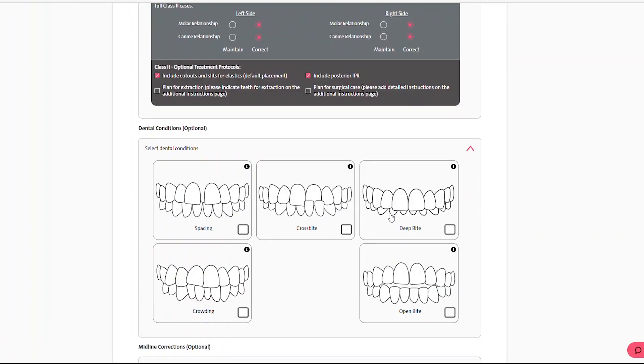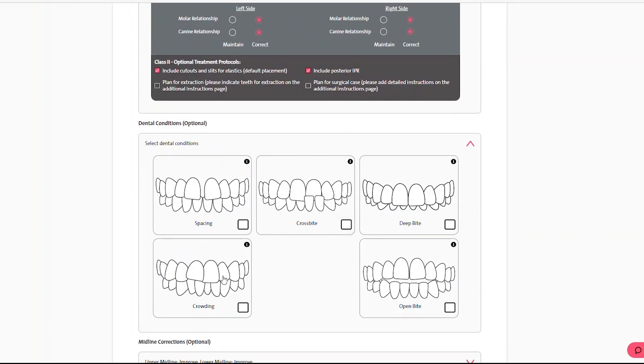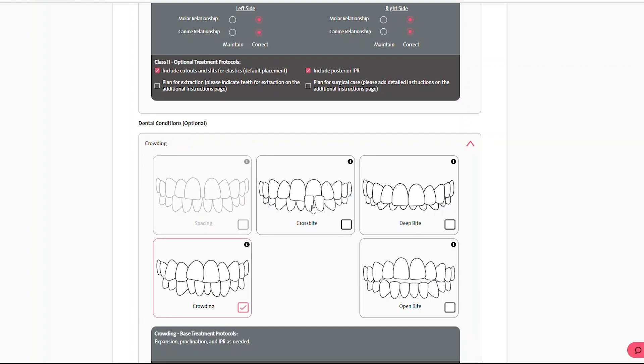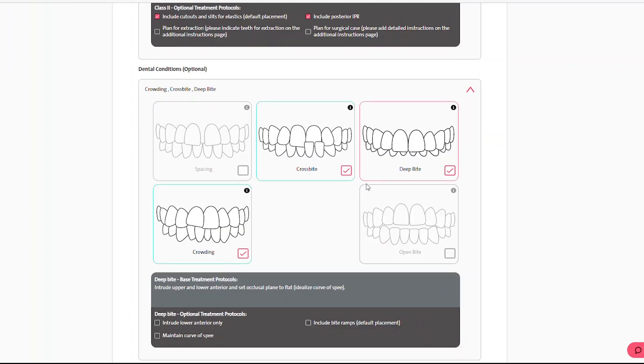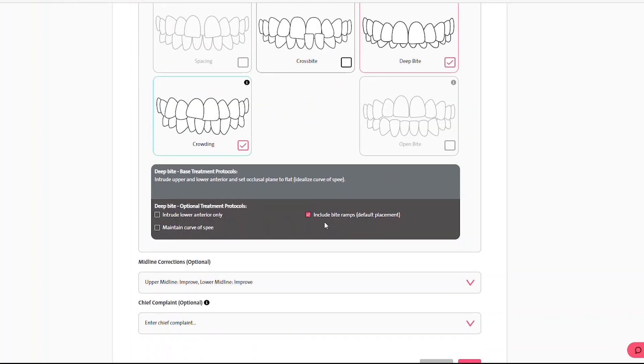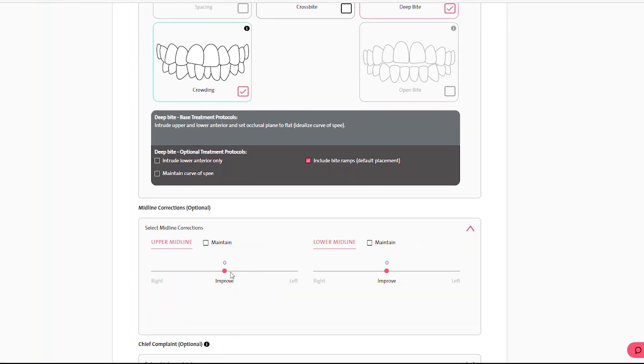This form displays different options dynamically based on case complexity, dental conditions, and your specific treatment preferences to provide a more intuitive and customized experience.